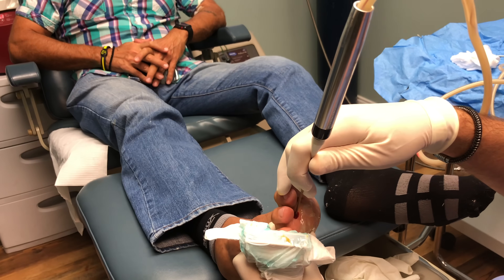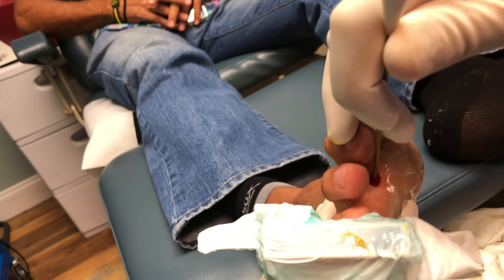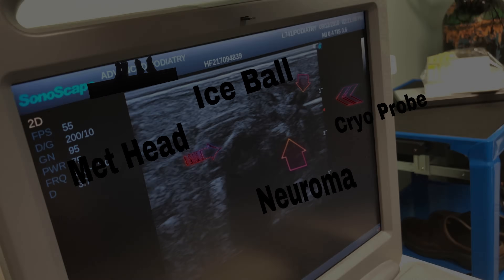And then as it forms, I'm going to put it on there again so you can kind of see that black ice ball that's forming.